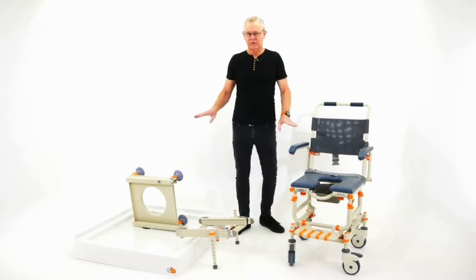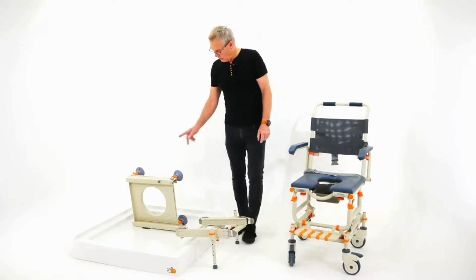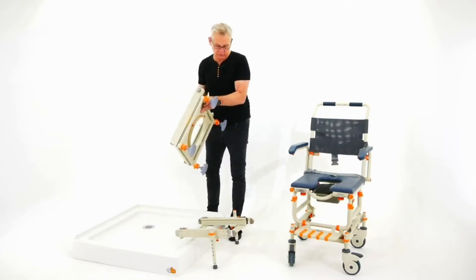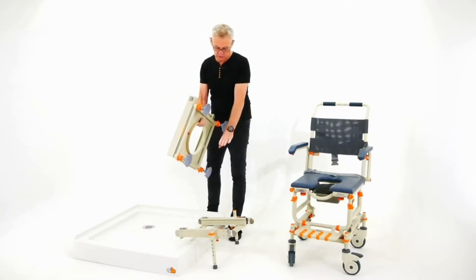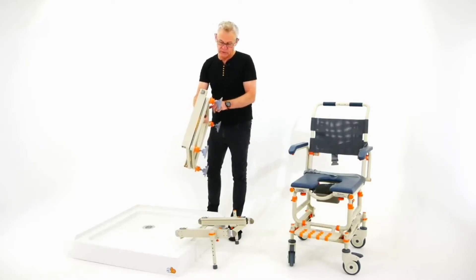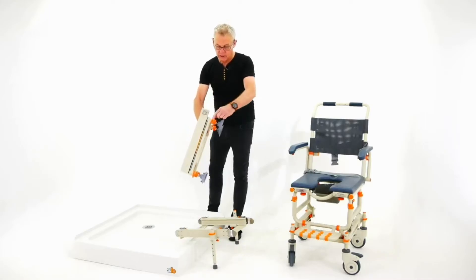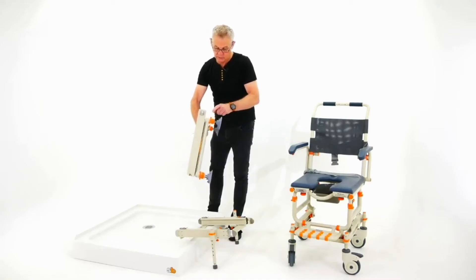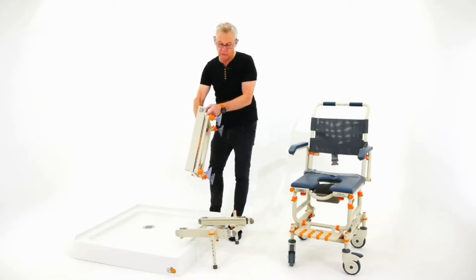Now let me show you the setup of this unit. We have a base unit, and the base unit is adjustable — everything is adjustable in height: the chair, the bridge, and the base unit. You set the base unit up for the shower at its lowest setting, pushing the legs right up. These clips are removable by a twist and pull, and they have one-inch, or 25mm, increments of adjustment.